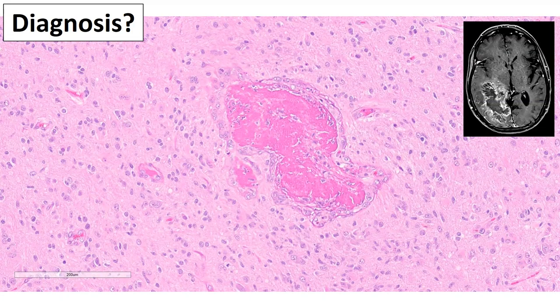No one recognizes what's in this blood vessel? It's a glioblastoma, IDH wild type. Yes, ma'am. Thank you, Dr. Gilbert. Yes, that's it. This is an intravascular fibrin microthrombus, which is highly associated with IDH wild type genotype in glioblastoma, as opposed to IDH mutant grade 4 diffuse astrocytoma, which tend not to have intravascular fibrin thrombi.